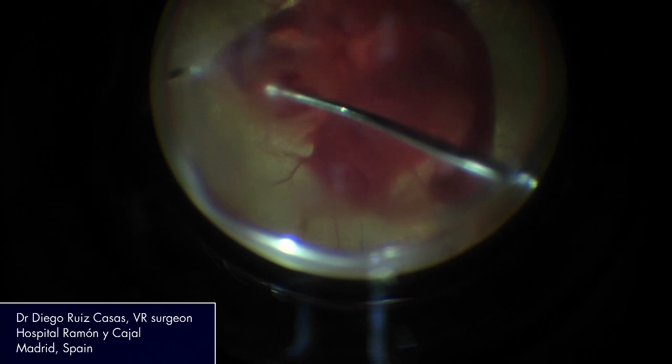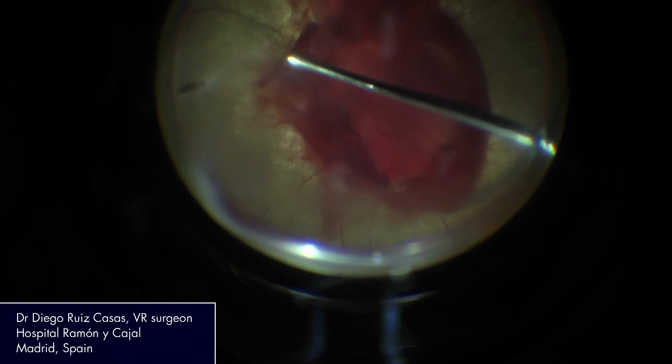Apart from being complete, the IVA system is pretty adjustable. If you are a surgeon that is used to using the peristaltic pump or that is used to using the venturi pump, you can adjust the pump the way you want.